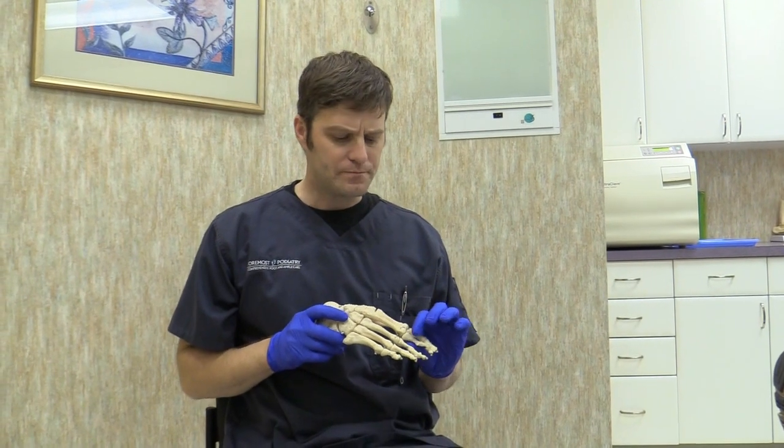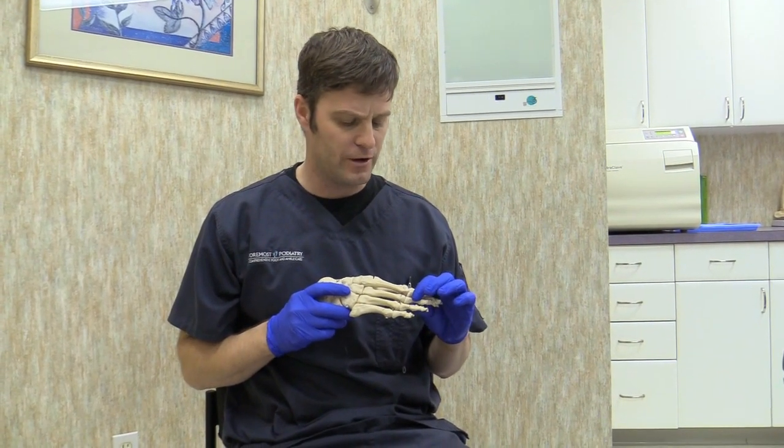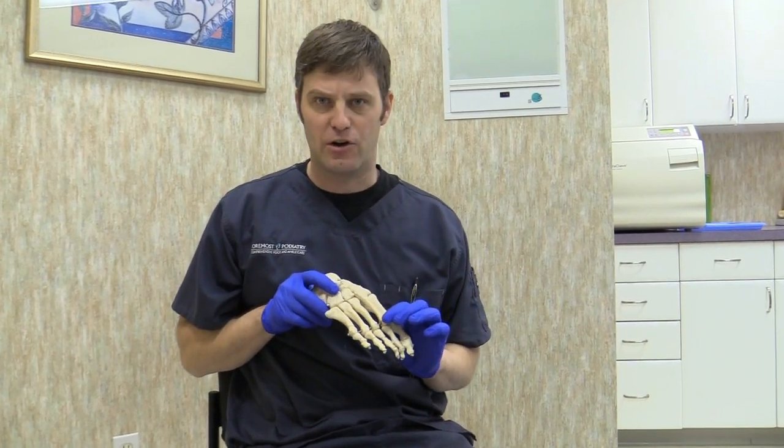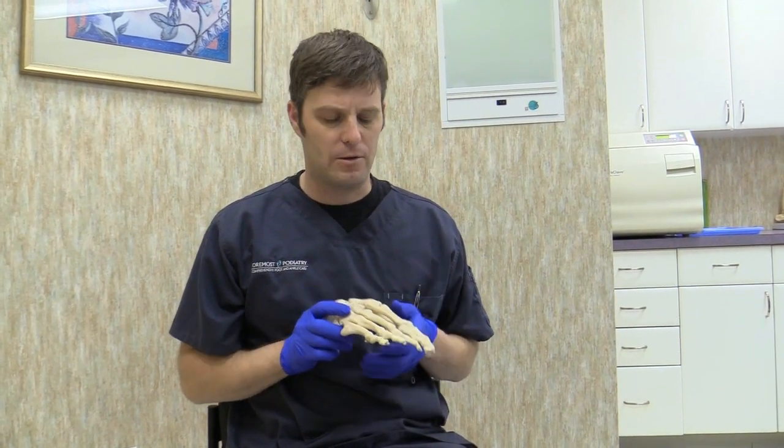Today I'm going to talk about a taping or a splinting for one of the lesser toes, usually the second or the third, to stabilize the metatarsophalangeal joint. We use this for different types of toe problems.